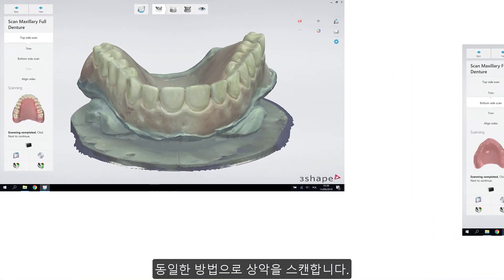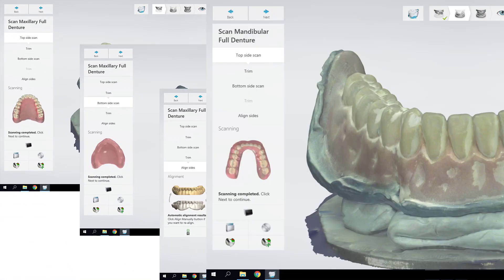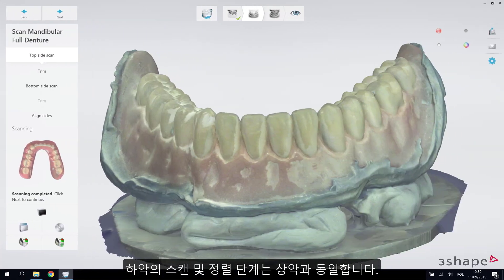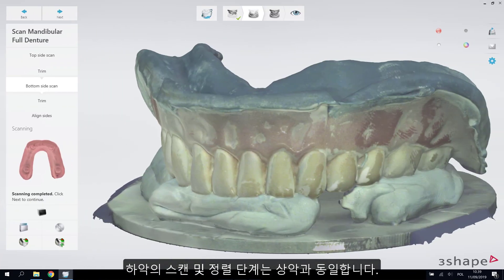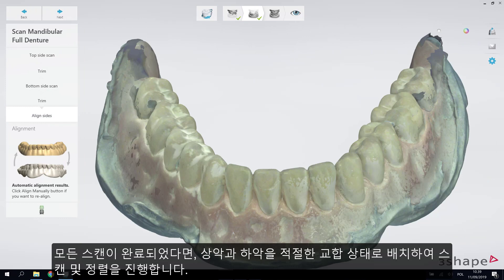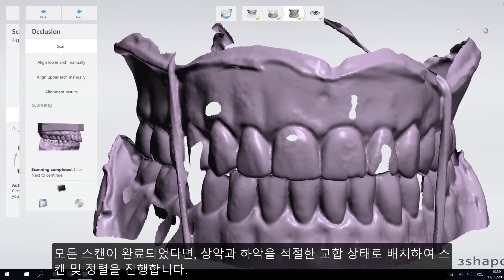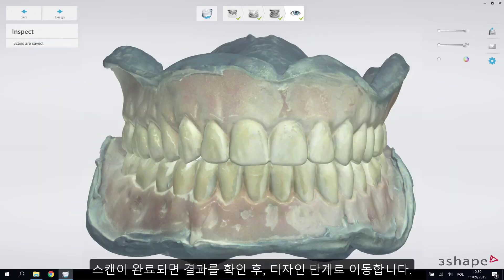Scan the upper jaw as shown before. For the lower jaw, repeat the scanning and alignment steps as for the upper jaw. After both upper and lower jaws are scanned, position them into proper occlusion and proceed with scanning and alignment. Once the models are scanned, inspect the output and proceed to the designing steps.